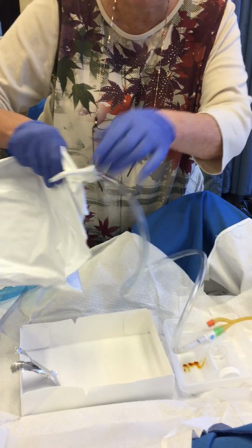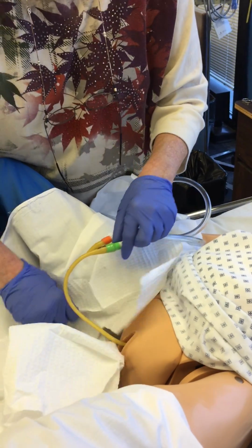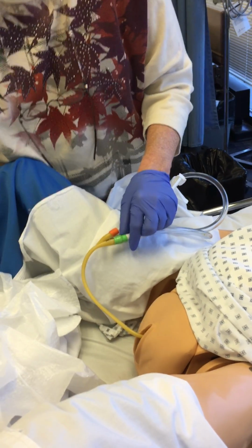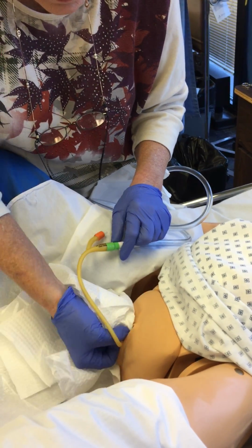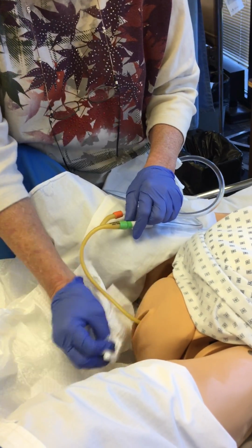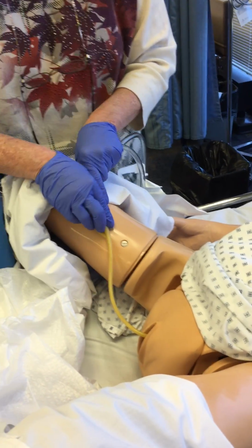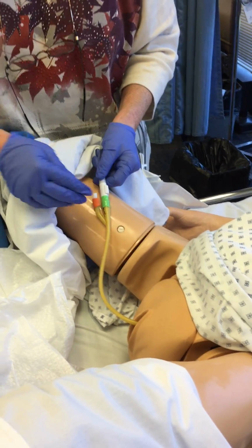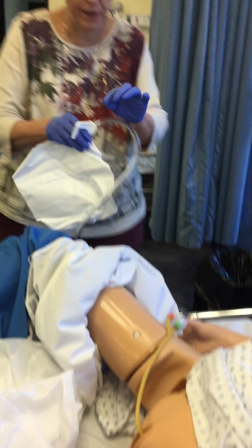What I didn't get was a catheter strap. And this can come off. This can come out. If you have more soap and water close by, you can do some more peri-care, but you can use this if it's not too dirty. You're going to attach this to her leg, right here. Like I said, forgot to bring the strap. Usually the straps come with the kits. And this will go on the non-movable part of the bed with this clip.